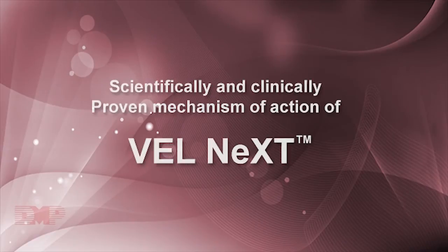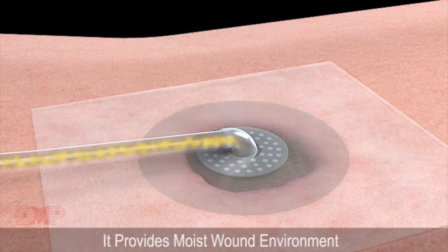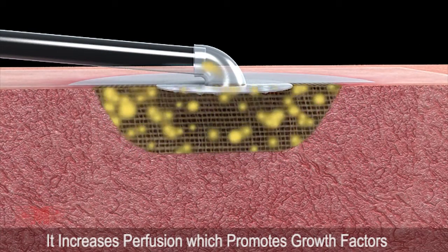Scientifically and clinically proven mechanism of action of Velnext. It removes exudates from the wound and reduces edema. It provides a moist wound environment. Moist wound healing decreases dehydration and cell death. It increases perfusion which promotes growth factor activity.